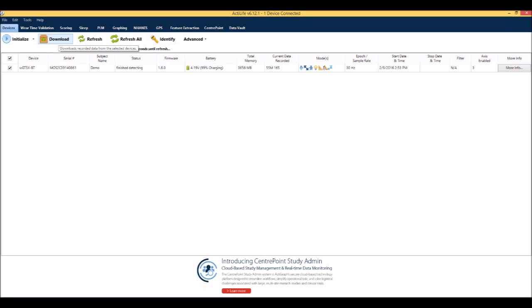After the device has been worn for the desired amount of time, you are ready to download the data. Open the ActiLife software, then plug in the monitor. Verify that the box next to the device is checked and select Download from the menu.